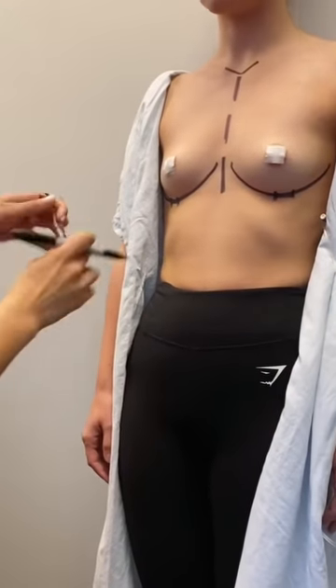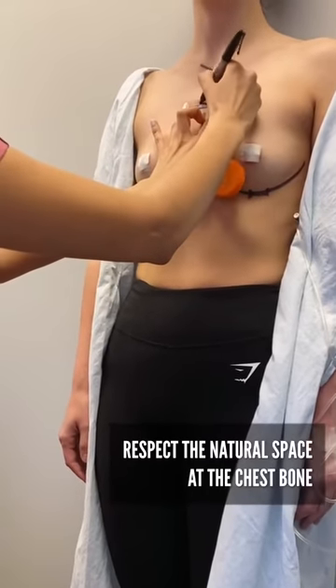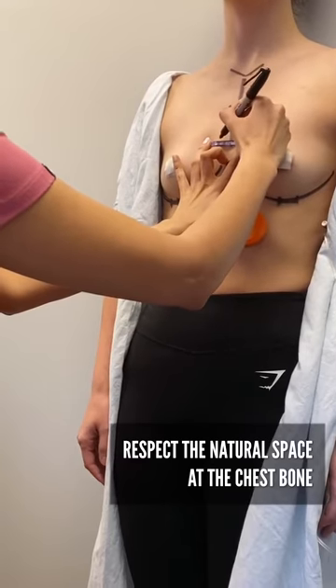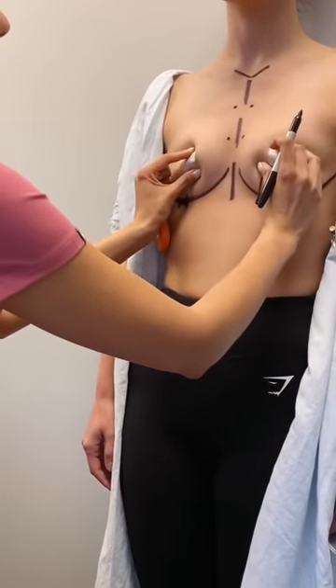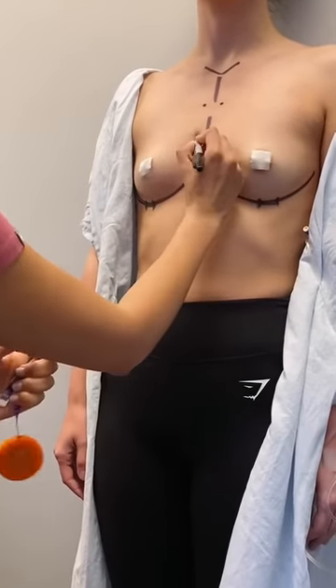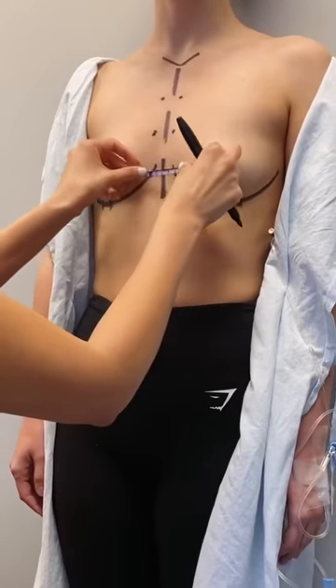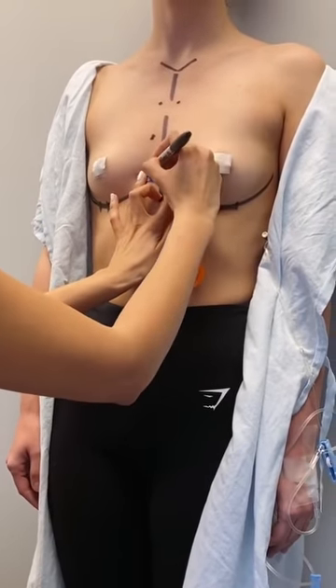The other thing I always make sure to do is respect the natural space she has at her chest bone, or sternum. This is really important because I'm going to give her great cleavage with her implants, but I always want to make sure they don't get too close together — that's how we get symmastia, which is very difficult to correct and doesn't look natural at all.